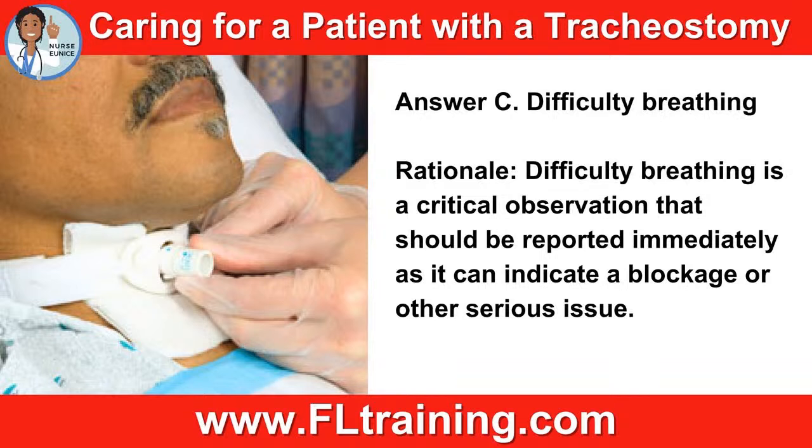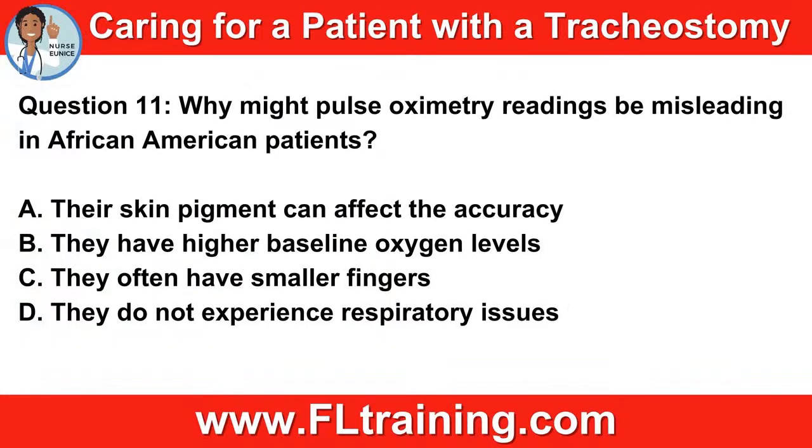And when your nurse comes in, if she's not able to advance that catheter to suction those secretions out, she can always remove the inner cannula. So some of your trachs have an inner cannula that can be removed. We take one out, put a new one in, and hopefully the patient will feel better faster. But it's all because you, as a CNA or PCT, actually noticed the patient having difficulty breathing and got that nurse in there.